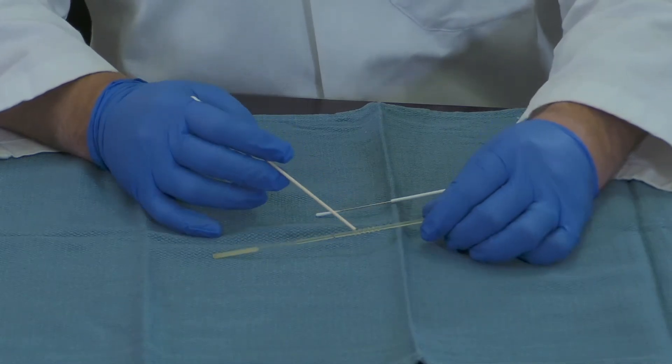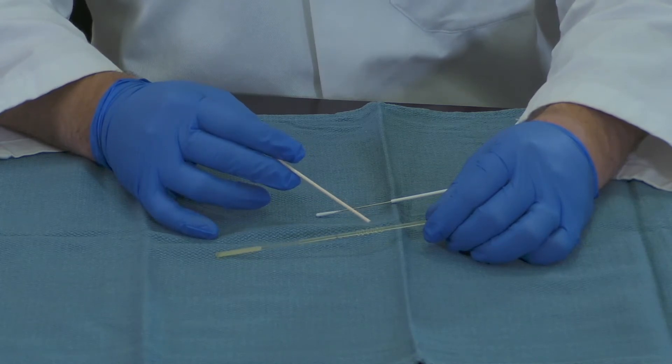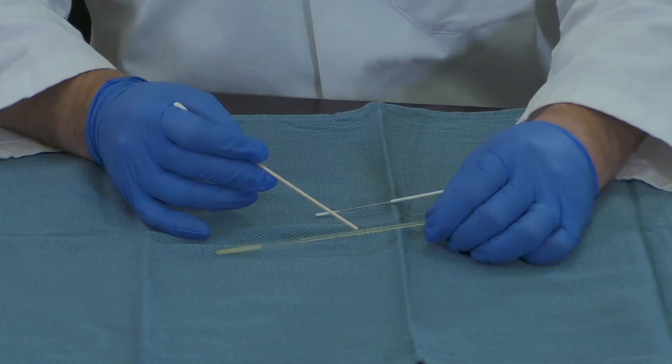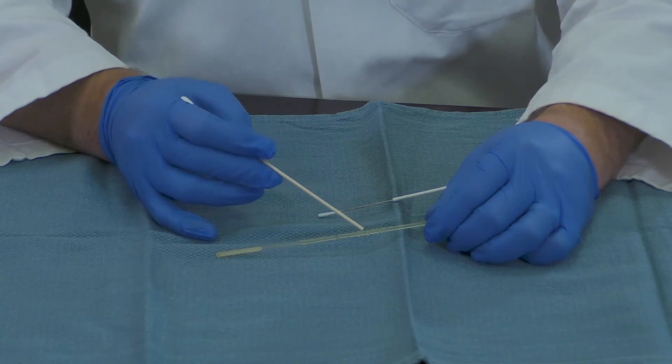It has these very specific 3D grooves to note the depth of your specimen. These grooves have been placed at 9 centimeters and 10.5 centimeters at the greatest depth. Anywhere in this range is your target for specimen collection.